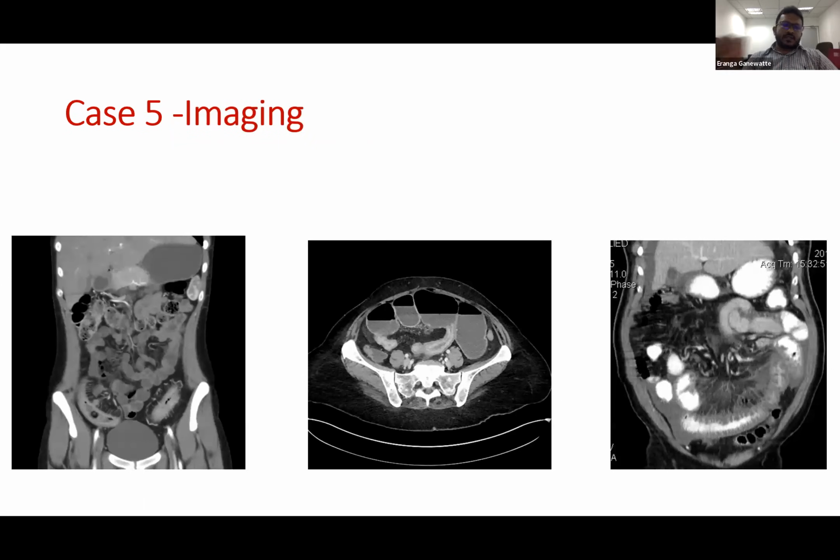So imaging the small bowel with the newer high-slice CT scanners and MRI, doing an MR enterogram or a CT enterogram doesn't make much difference in specificity or sensitivity between those two imaging modalities. But the only benefit of MRI is that there's no ionizing radiation involved, especially in these kinds of patients where you need to do follow-up studies.